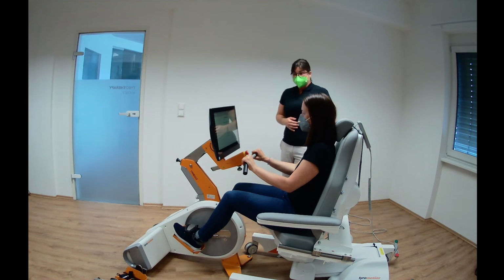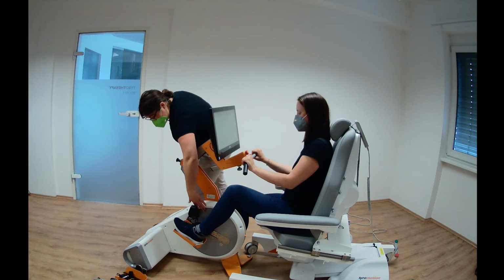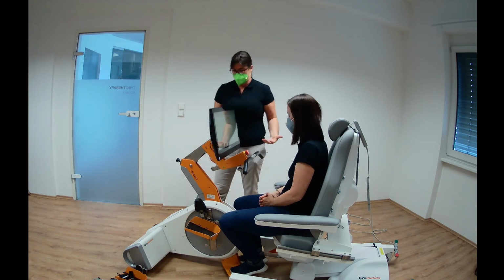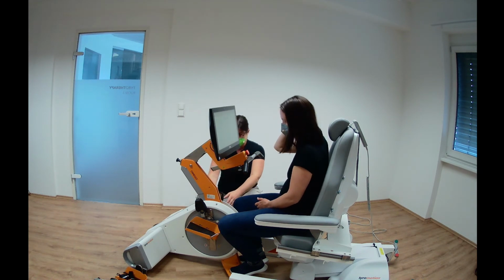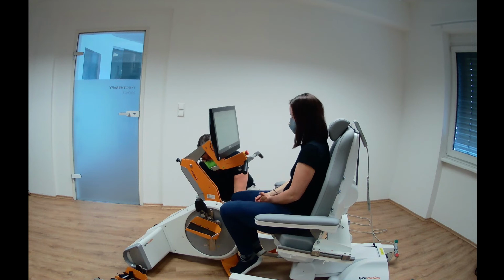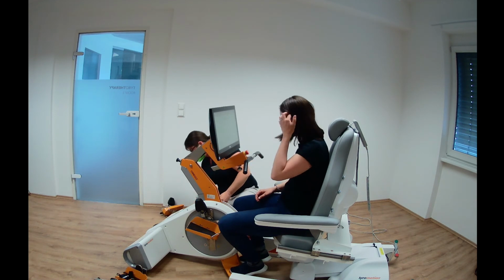And for the next therapy, we have to change the footrests because it's the ankle joint training. And this is a training which is, in my point of view, the most underestimated therapy we have with Omego. So first of all, we change the footrests. Thank you. So we press the security switch. Afterwards, we change the footrests. I will do it now on this side, and afterwards on the other side.